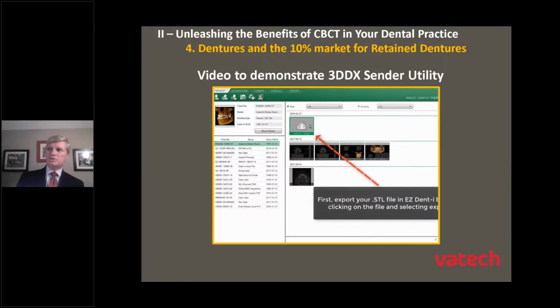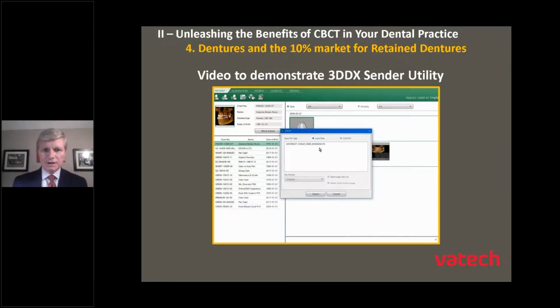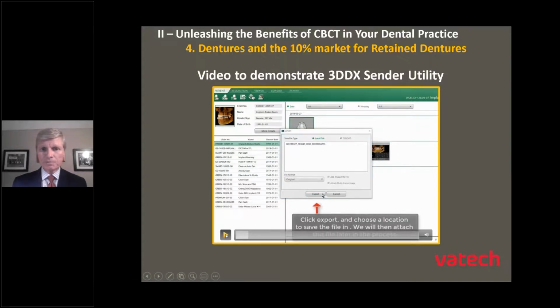In this case, what I'm going to do is start from the EasyDent software. And just as a quick side note, for those that want to view this in greater detail, this video actually came directly from our Customer Learning Center. If you go to the 3DI portion of our Customer Learning Center, there is a 3 or 5 minute long video that goes through this step by step with audio and the pop-up, as you see here, to go through the steps to export the scan out, or the denture or stone model in this case, and then upload it to 3D Diagnostics.